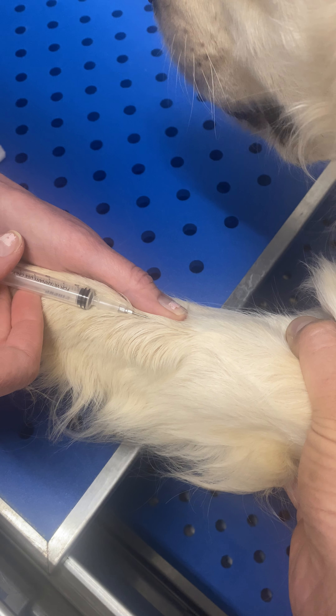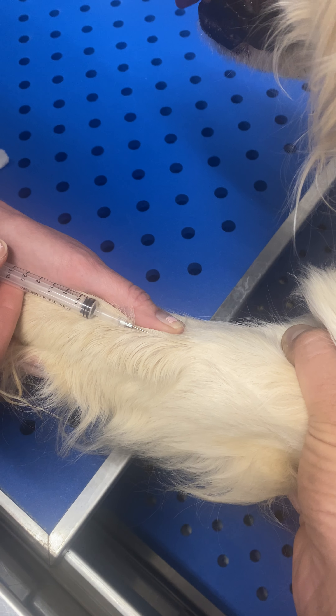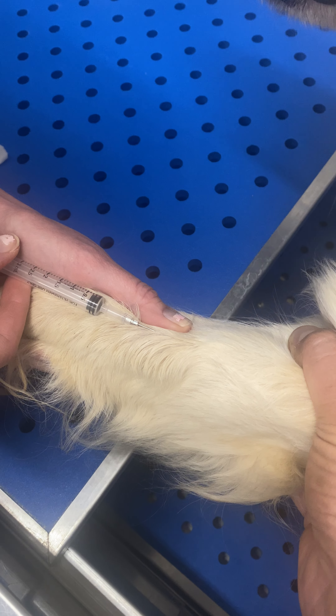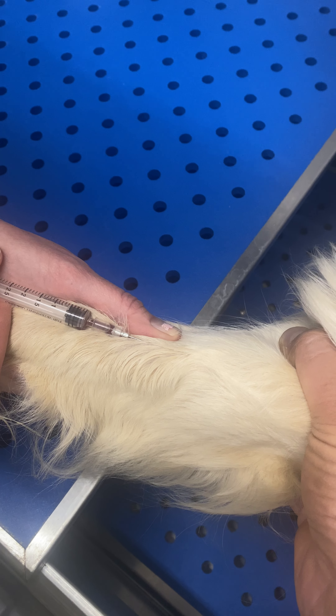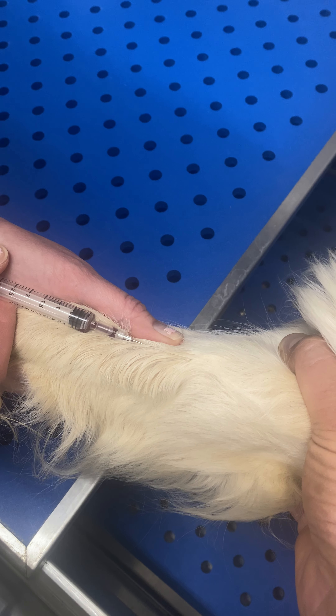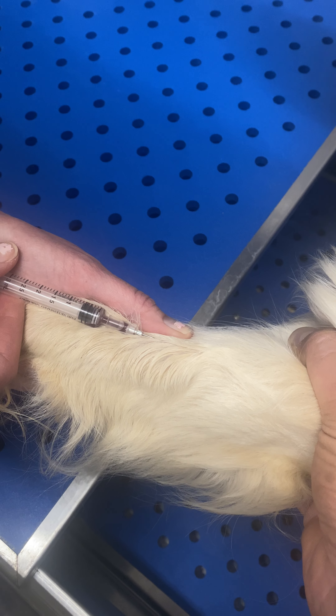As soon as you get into that vein you'll see some blood squirt into your syringe. And there you go. If you aren't quite getting blood as you're drawing, you're going to just pull your needle out just a little bit.